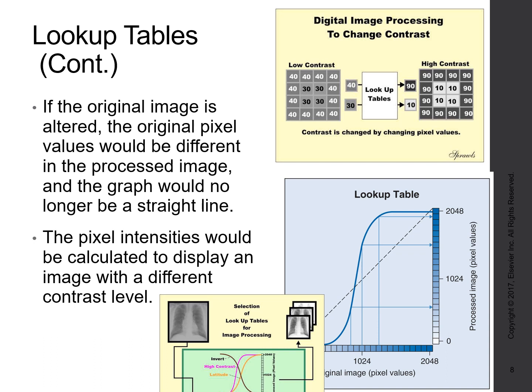So here's an example. Let's say that I had this very low contrast image in my raw data. I superimposed it over my lookup table. It adjusted that image to the lookup table, and that lookup table sent the same image out, but it adjusted it to a more contrasty image.